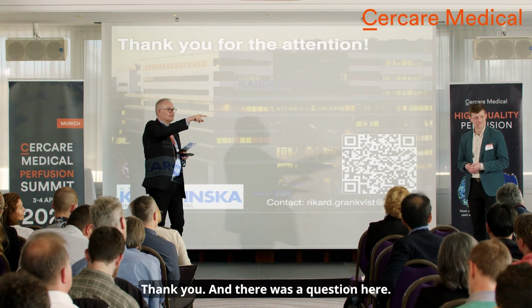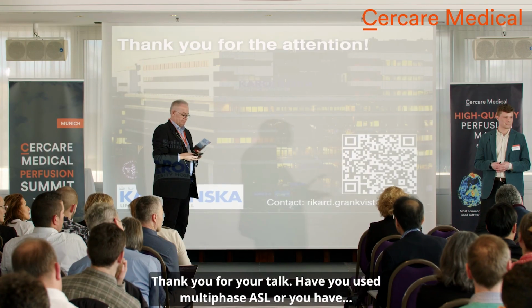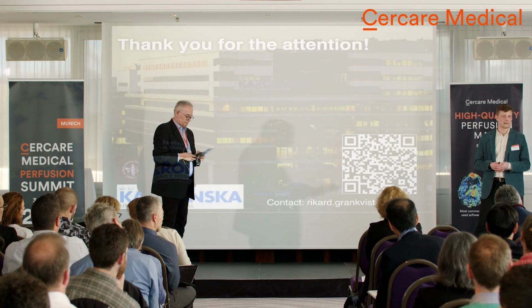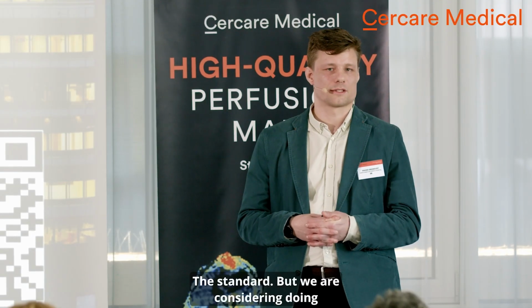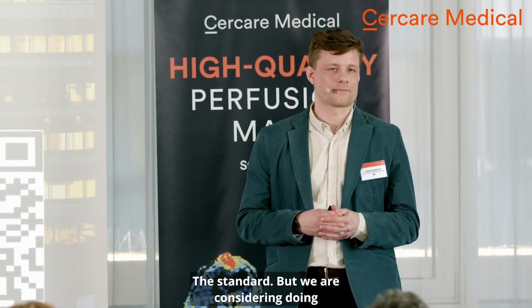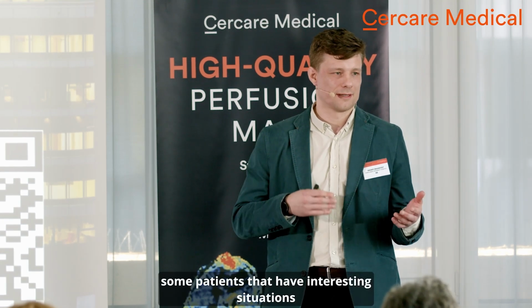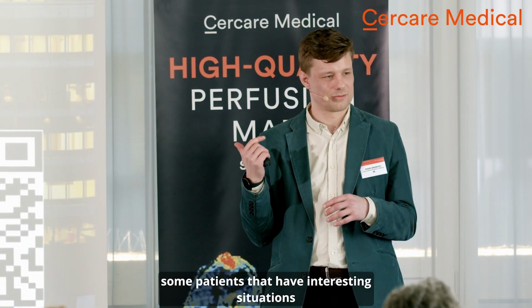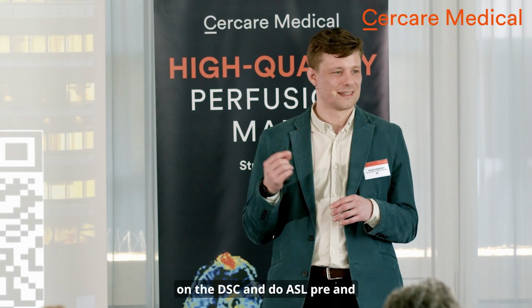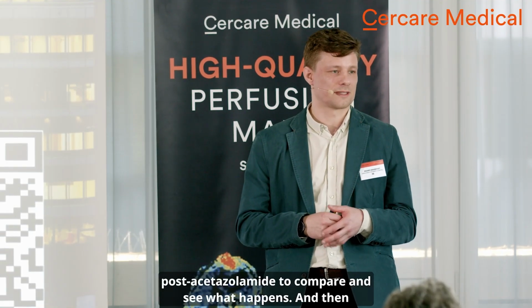Great, thank you. And there was a question here. Thank you for your talk. Have you used multi-phase ASL? No, not that I'm aware of. I don't think so, but we are considering doing an ethics application to be able to invite some patients that have interesting situations on the DSC and do ASL pre and post acetazolamide to compare and see what happens, and then we can do a little bit more extensive ASL.